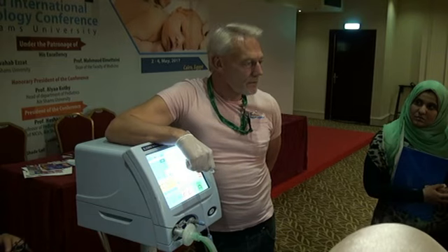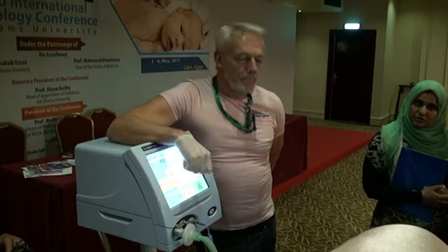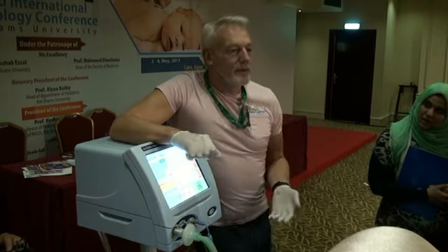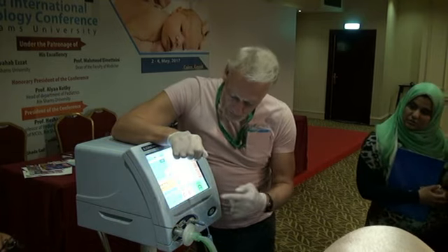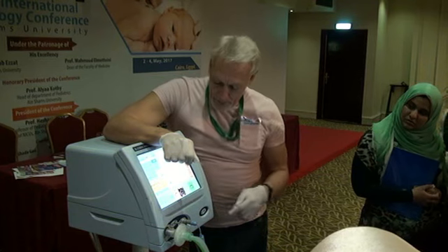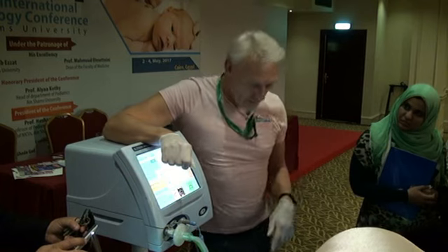Nothing's changed. Few minutes and they will change the... Yeah, I mean, I don't know the right answer. I probably wait a couple of minutes before I would do. I don't know whether this machine will allow me to take it up much higher, but actually, can you see it getting thinner? This is a very nice compliant lung.